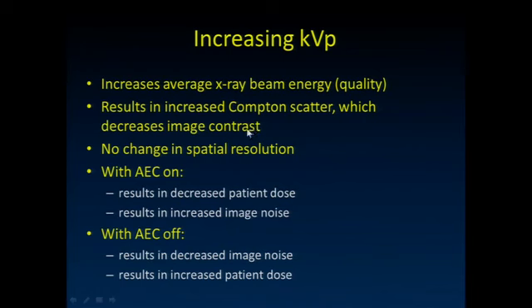We prefer to first change the mA to get appropriate image quality if we can, and not change the kV unless absolutely necessary. It doesn't change our spatial resolution.